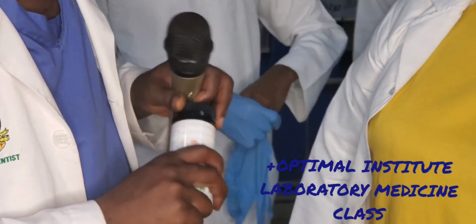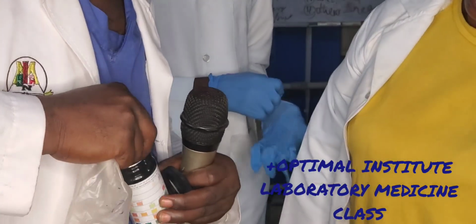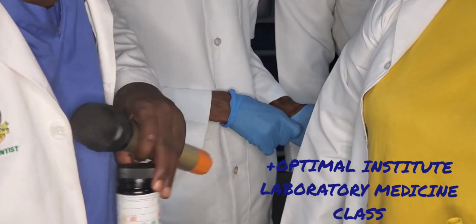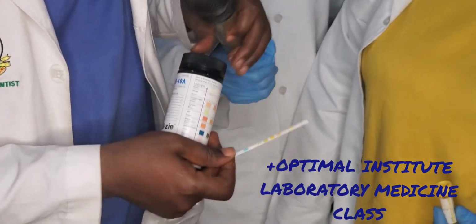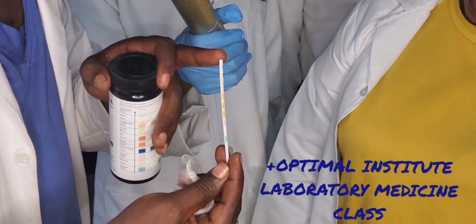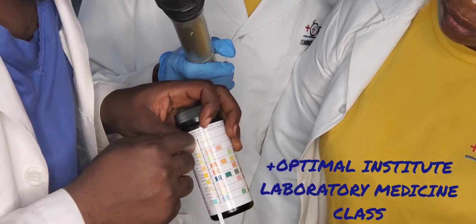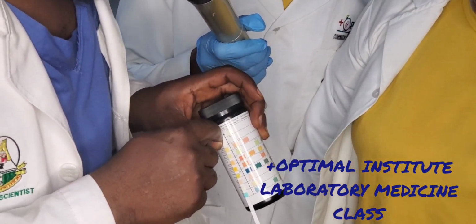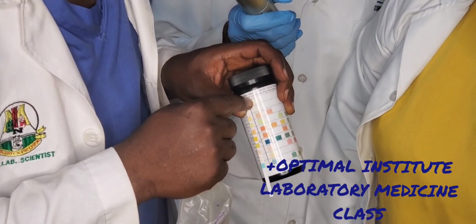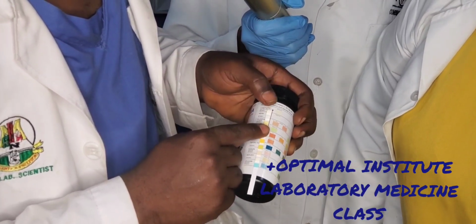If the color matches when we put the strip in the urine, this one is number 1, leukocytes. If this color, which is leukocytes, matches the first color under leukocytes, it is negative. Number 2 is nitrites. If the nitrites color matches this, it is negative. I first put the strip in the urine and then compare all these with the first color.